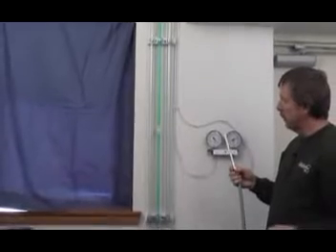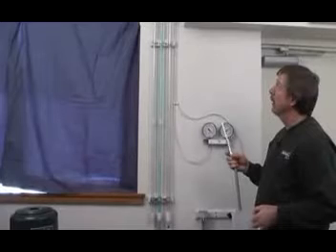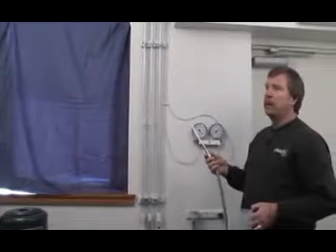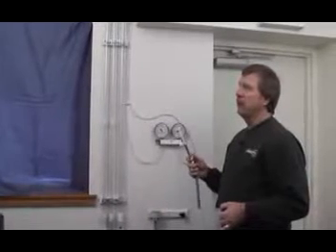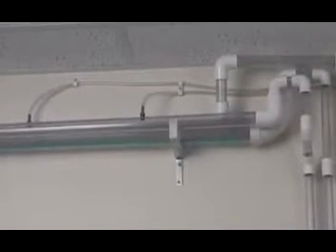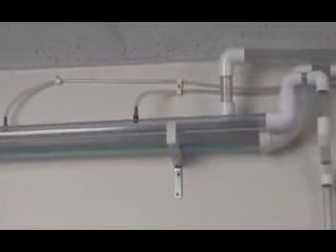As you open up the suction, it helps clear the lines and move the liquid into the trunk line and down towards the collection tank. And when you shut that, the flow of liquid stops. So if you suck up X amount of liquid, that does not necessarily mean that X amount of liquid will end up in a collection tank. It can sit in the trunk lines because it has nothing to cause it to move. When you open up the suction device, this introduces air into the system, which is pulled back through the collection tank and vacuum pump, and that in turn moves the liquids and solids down the trunk line.